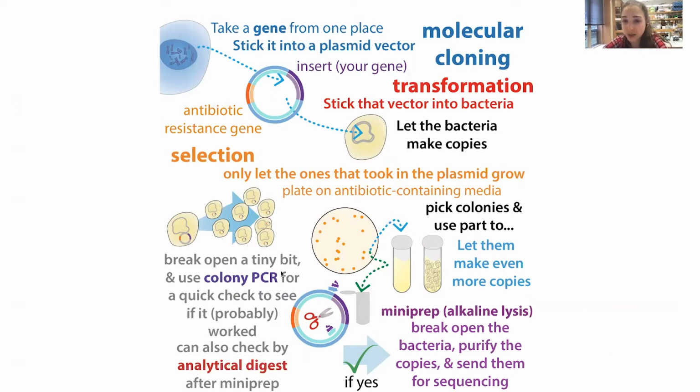We put that in as well as the gene, or whatever information we want, in the plasmid. This way, when we spike their food with the antibiotic, we're only going to allow the ones that have the plasmid to survive. The ones that survive are going to grow on top of themselves in these colonies, these loopy dots, and then we can isolate stuff from there if we want. But basically, we only want to feed the ones that we want to survive.